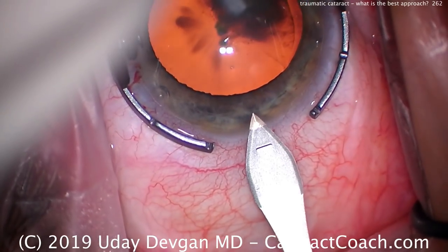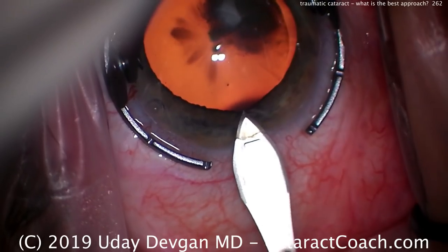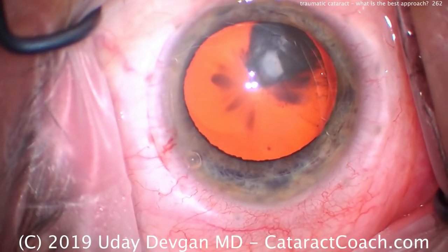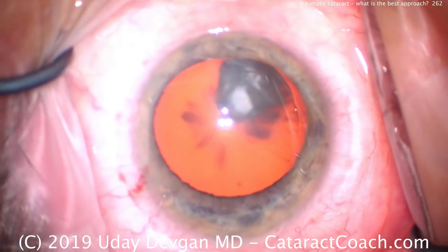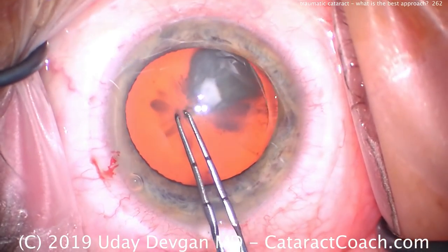You know, this patient had an injury from a bungee cord, which is like an elastic band that was quite forceful, and it hit his eye 40 years ago. And he didn't seek any treatment until recently when he got these central cortical spokes that are causing his vision to decline. Let's start our rhexis.